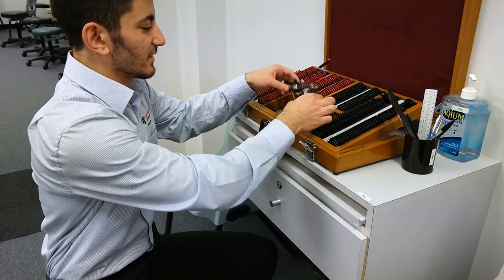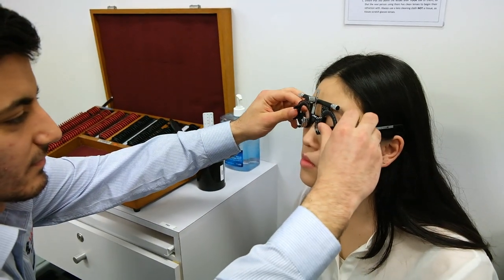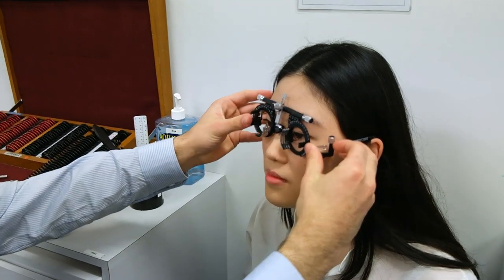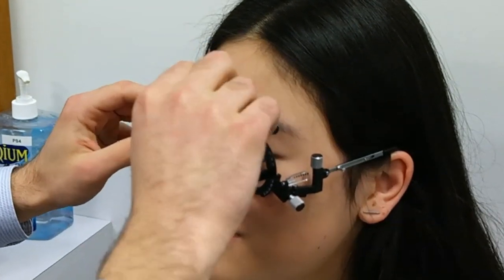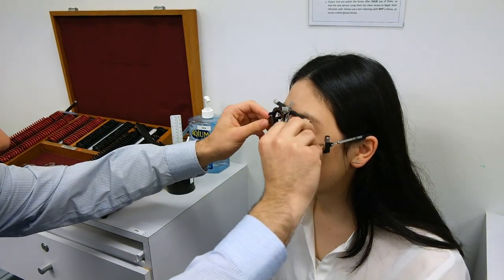Okay so I'm going to test your vision and see if you can be corrected with glasses. I'm just going to pop these trial frames on you to help with the test — just tell me if they're comfortable. Zane adjusts the trial frames ensuring proper IPD, nose height, and that they are sitting comfortably.